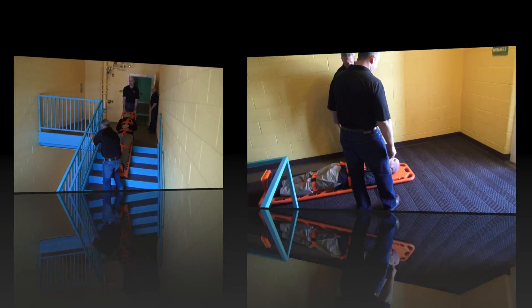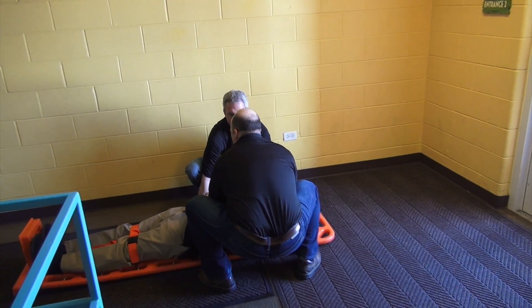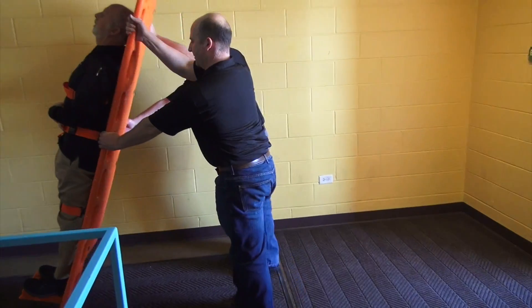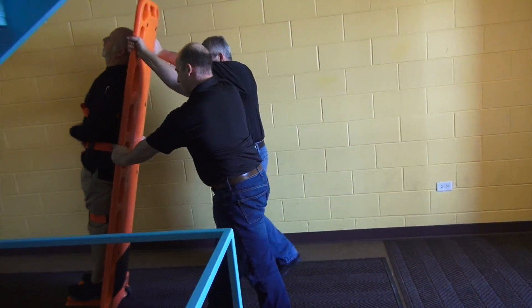The goal is to keep your arms straight, align the patient over the wheels, and let gravity do the work for you. If your elbows are bent, your arms and back are doing work that the walkboard and gravity could be doing for you.